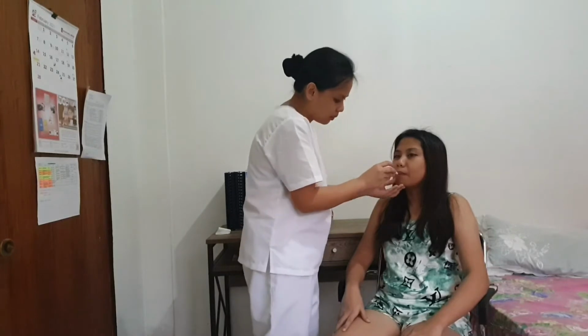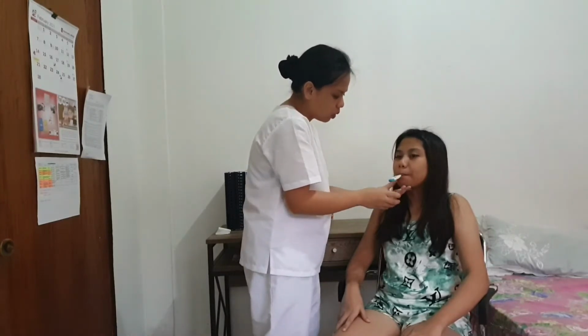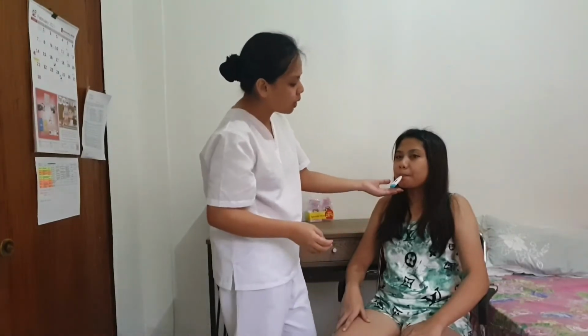Please hold it in place. We are going to wait until the thermometer beeps. We are using the oral method. This one is reliable because the location for the oral method is close to the sublingual artery.